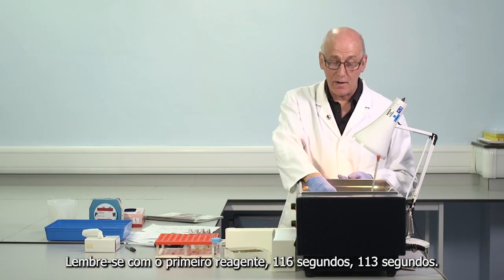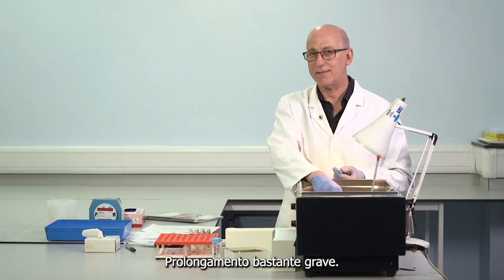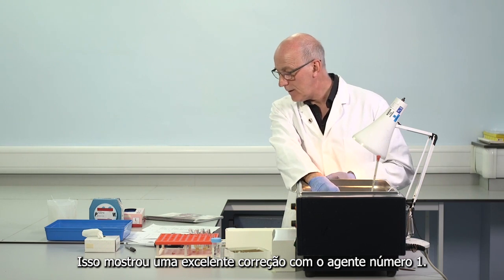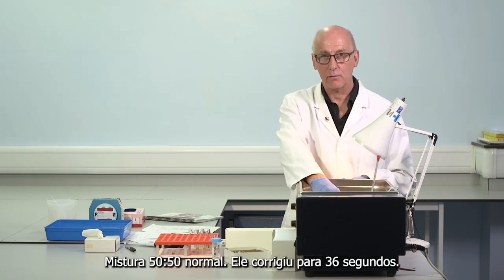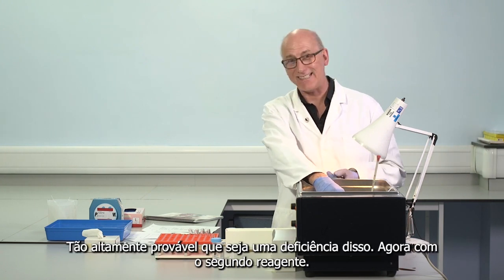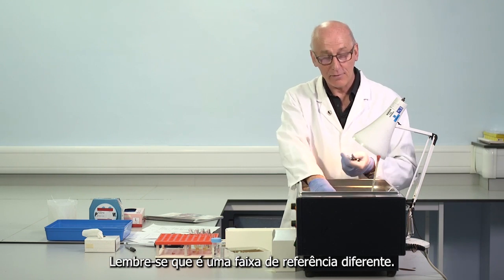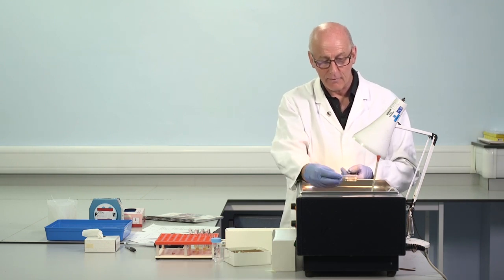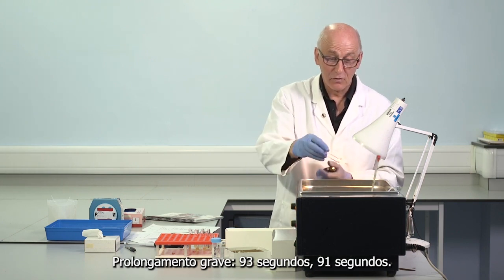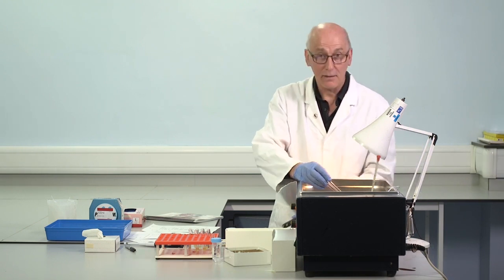So this is patient number 2 now, second reagent. Remember with the first reagent, 116, 113 seconds, pretty grossly prolonged. This showed an excellent correction. Reagent number 1, 50-50 normal mix, it corrected to 36. So highly likely to be a deficiency from that. Now with the second reagent, remember it's a different reference range, grossly prolonged. 93 seconds, 91.